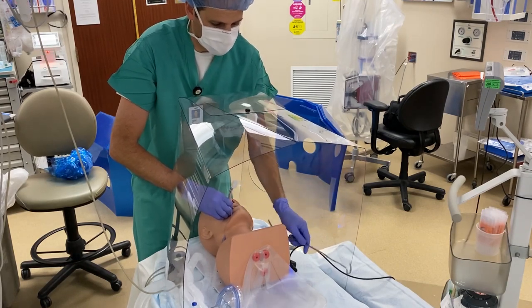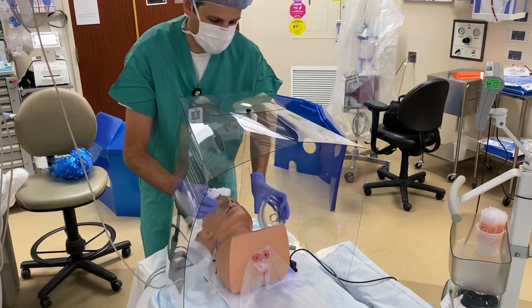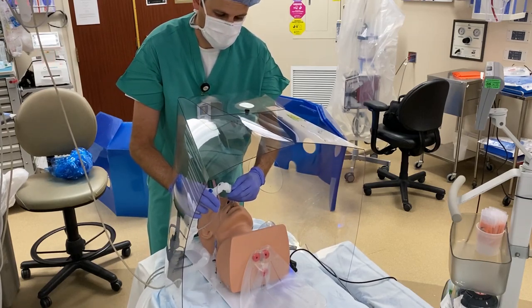When you no longer need them, they can lay flat and could easily fit in the corner of an OR, rather than taking up a lot of precious real estate.